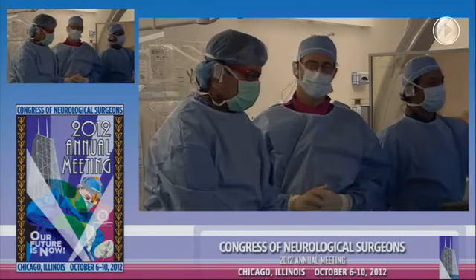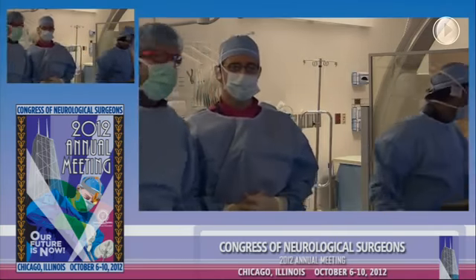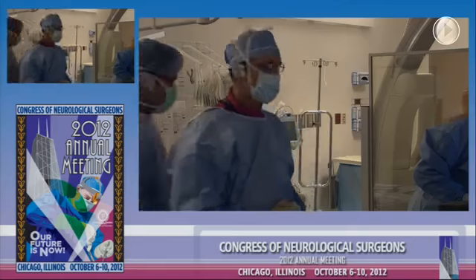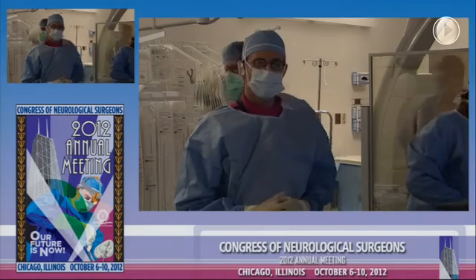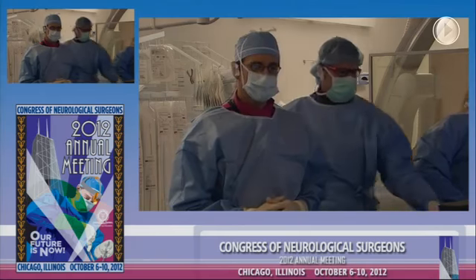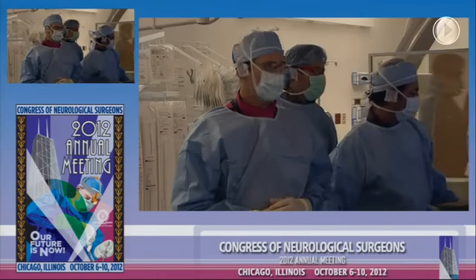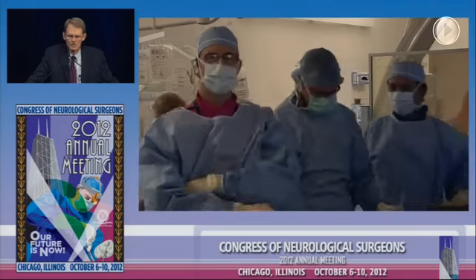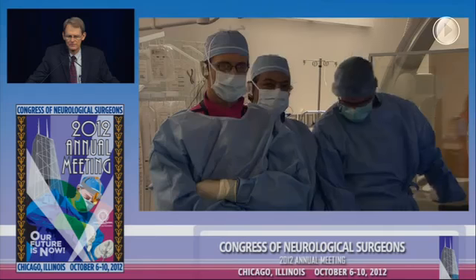Nick, any final comments? Well, I think that you mentioned the posterior circulation morbidity, but most of the morbidity we've had in the posterior circulation has been in patients where we had a real big fusiform aneurysm and where we used multiple stents. And in that situation, we've had complications. It'll be interesting to see as we go forward whether we can reduce the rate of significant morbidity by placing only one stent across a large vertebral basilar fusiform aneurysm.